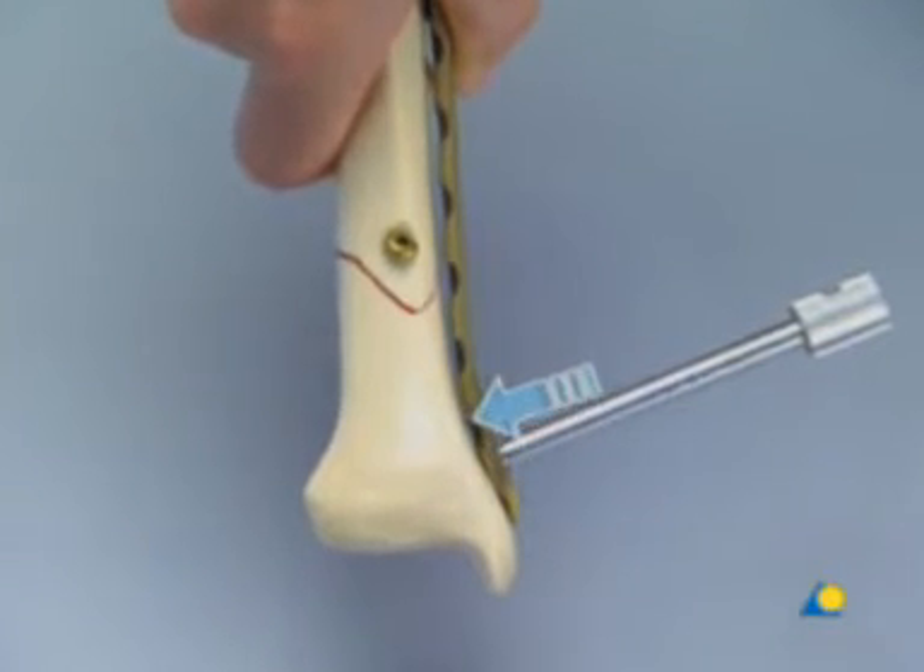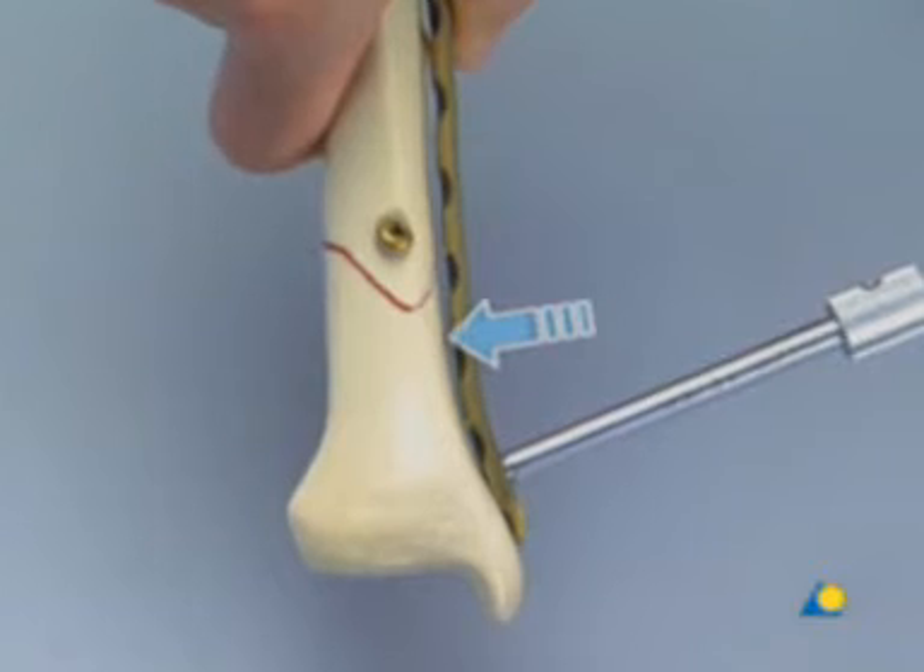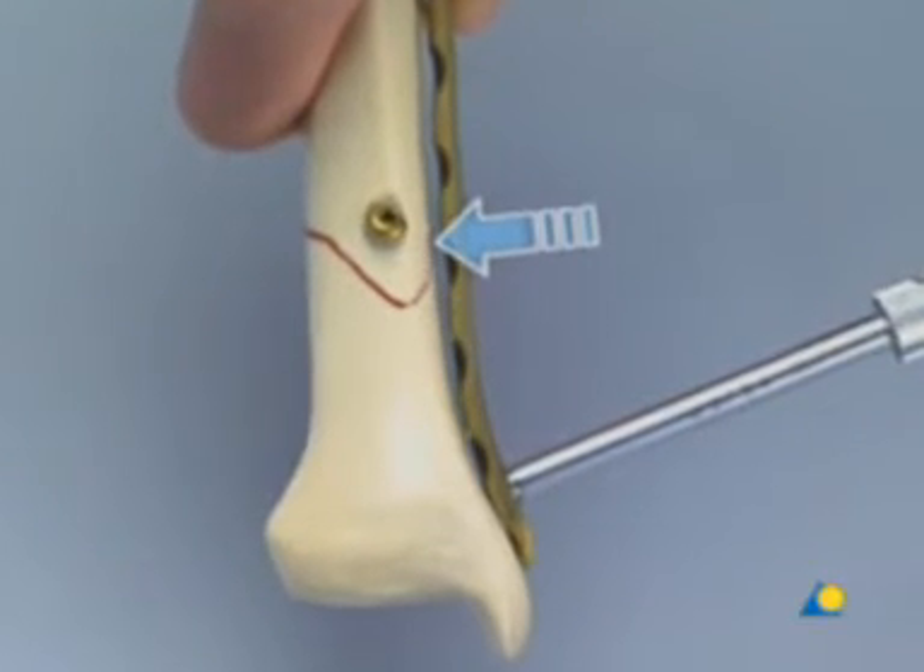Moving proximally, the plate does not touch the bone, nor will it need any additional contouring or torque.